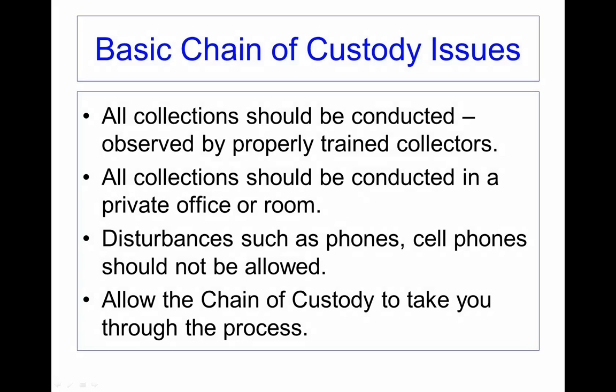Basic chain of custody issues. All collections should be conducted, observed by properly trained collectors. This can be done at the Immunalysis website. All collections should be conducted in a private office or room. Don't allow disturbances such as phones, cell phones, or others to enter the room while you're conducting a collection. And then allow the chain of custody to take you through this process.